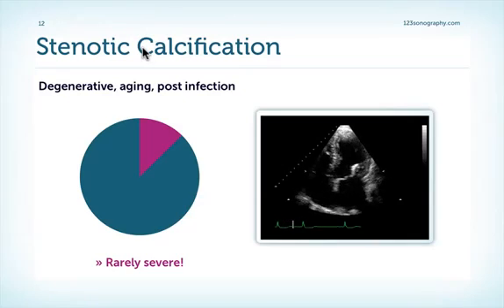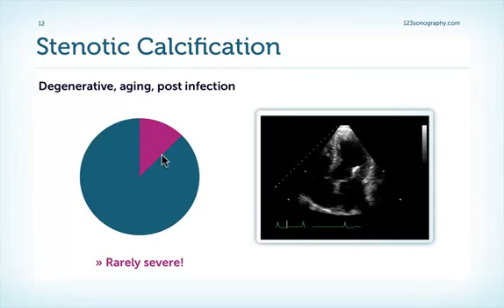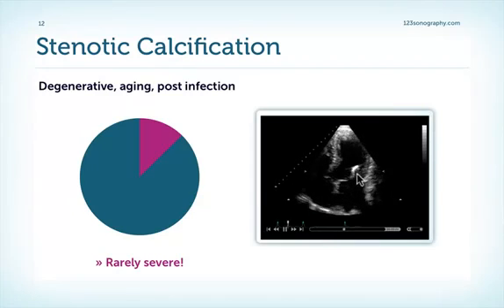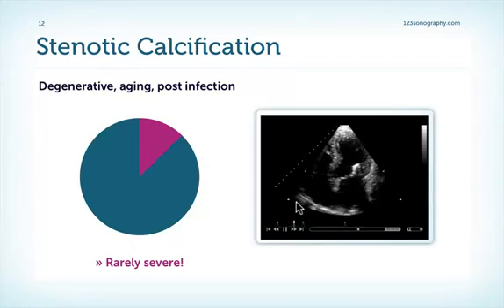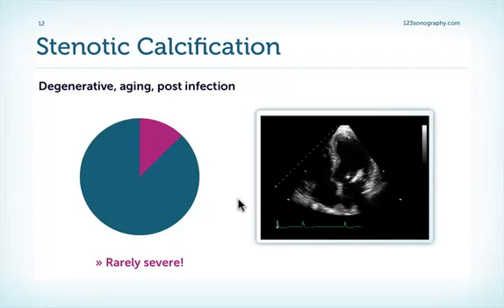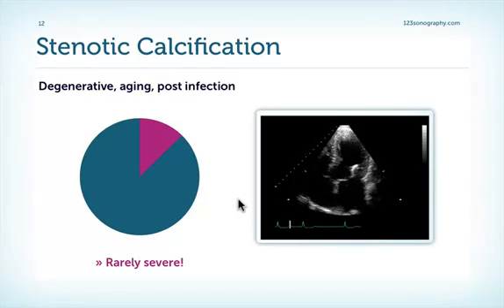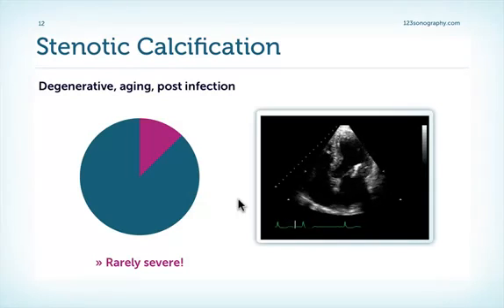The second most frequent cause of mitral stenosis is stenotic calcification. Here's an example where calcification spreads from the annulus to the mitral valve leaflet — the posterior leaflet — causing a reduction in mitral valve opening and thereby mitral stenosis. Very rarely however will we see significant mitral stenosis in the setting of stenotic calcification. You have to be aware that even dramatically affected valves can have secondary degenerative changes, and in end-stage disease it is often very difficult to say whether the primary cause was stenotic calcification or rheumatic heart disease.